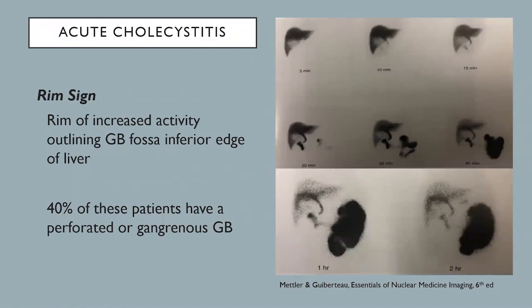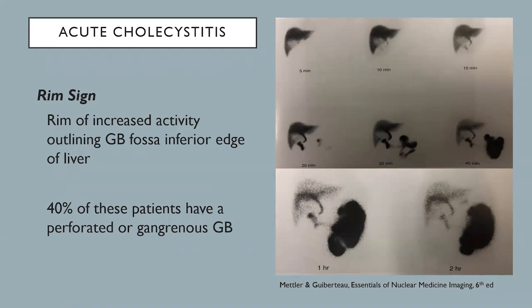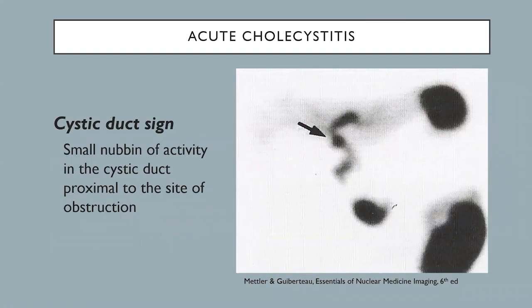This is another example of acute cholecystitis. Radiotracer activity in the liver, excretion into the common bile duct, and progression into the small bowel, but no radiotracer activity is seen in the gallbladder even at one and two hours, compatible with acute cholecystitis. Pay attention to this rim of activity outlining the gallbladder fossa along the inferior edge of the liver — this is a rim sign. With acute cholecystitis and rim sign, 40% of these patients have a perforated or gangrenous gallbladder, so it's important to communicate that finding to the referring physician or surgeon.